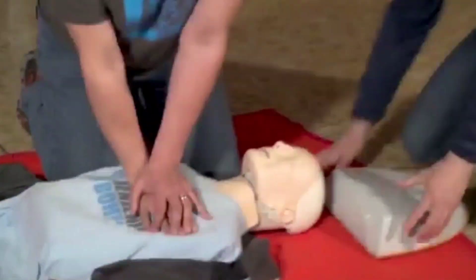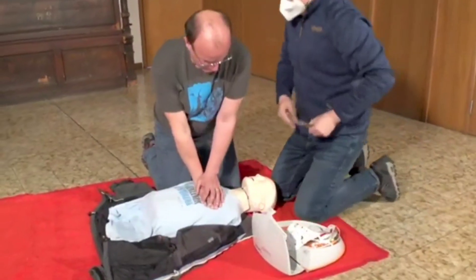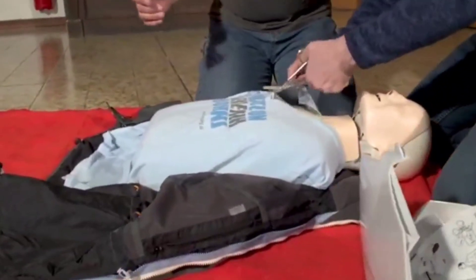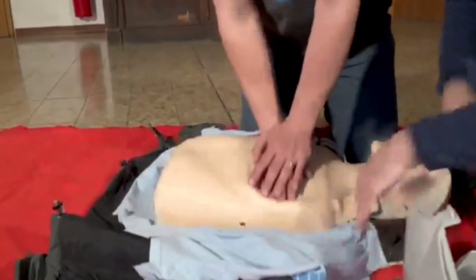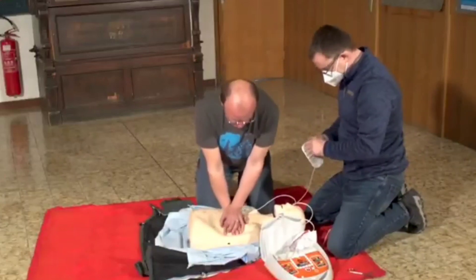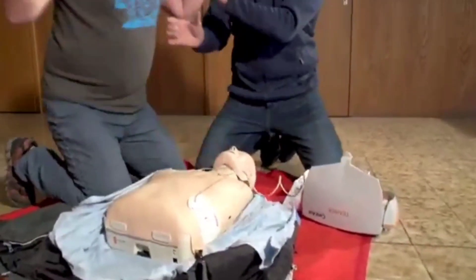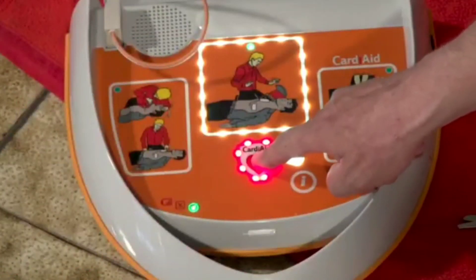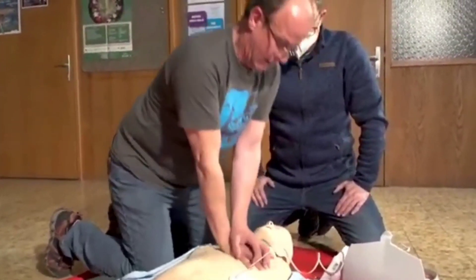The defibrillator is here. Allow him to fix the defibrillator pads while you continue CPR. Hands off — to allow the defibrillator to analyze Mr. Muhammad's heart rhythm. If you want to know how to defibrillate, watch the video up here after watching this one.